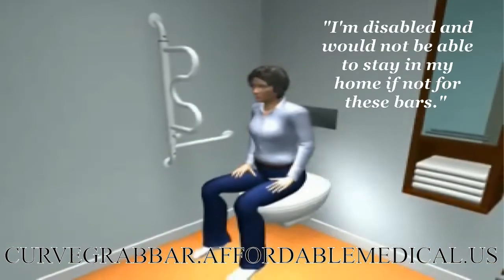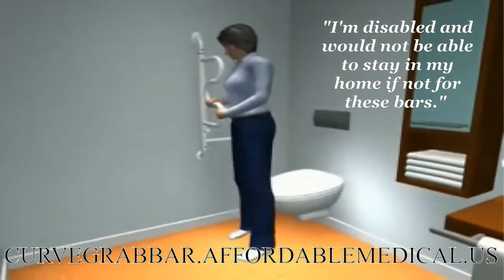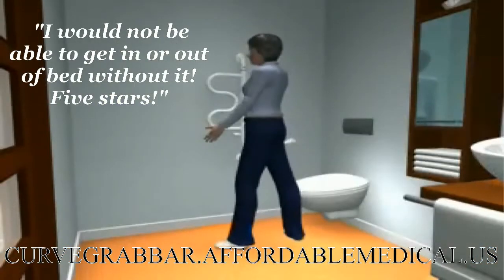I'm disabled and would not be able to stay in my home if not for these bars. I have them in both bathrooms and next to my bed, which is floor to ceiling. I would not be able to get in or out of bed without it.